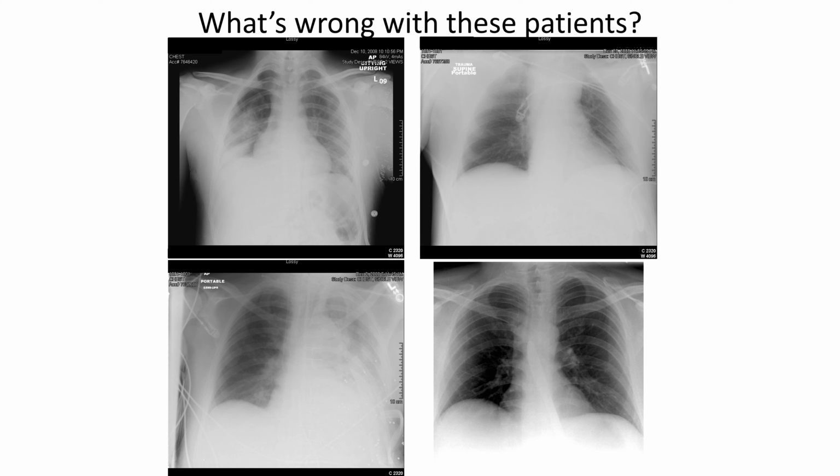So I just thought I would put them up here. The top left one, you can see some clues there. You can see some staples near the patient's left armpit. As with all medical imaging, typically the patient's left is on your right as you're looking at the screen. There's actually an L there too that indicates the patient's left.